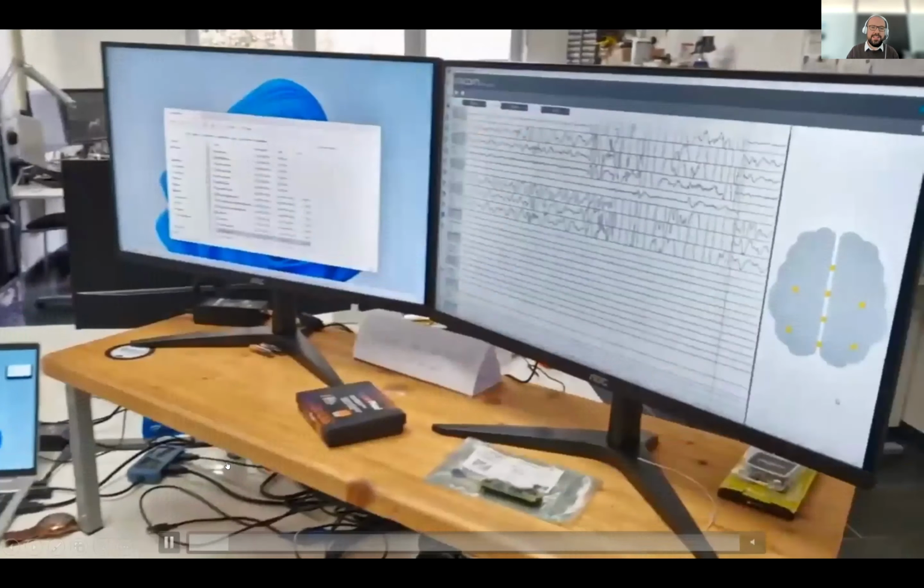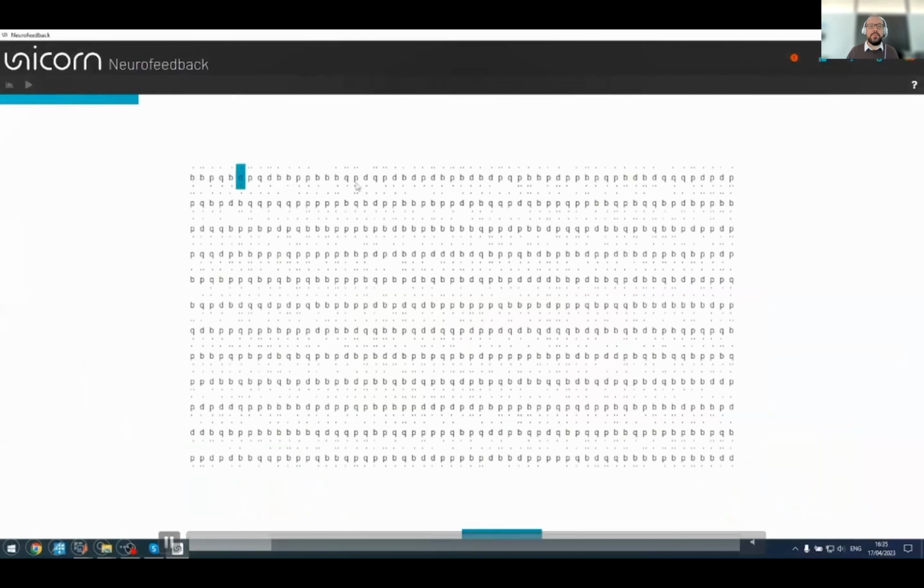So you can see different offices in g.tec, different desks. They were many, many meters apart, but they were all connected to our network. So we were able to receive the data in real time, process it, and get some results out of it. They had a resting state task, then they were asked to perform this D2 task requiring concentration.